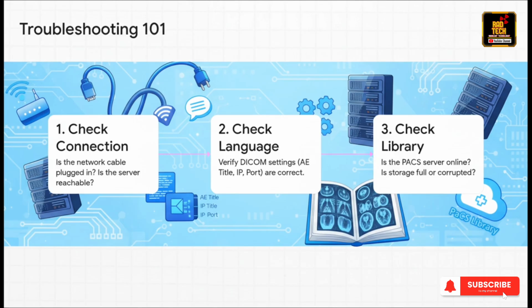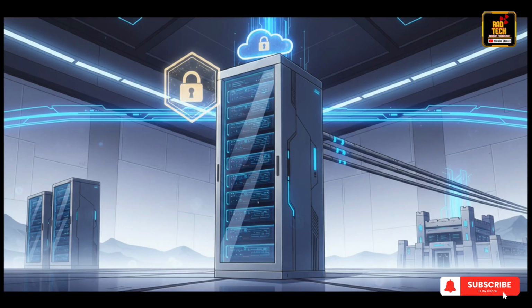Then they move to the language. Are the DICOM settings all correct? And finally, they check the library itself. Is the server online? Does it have enough storage space? It's a step-by-step investigation. And really, it's all the proactive upkeep that prevents most problems from ever happening.